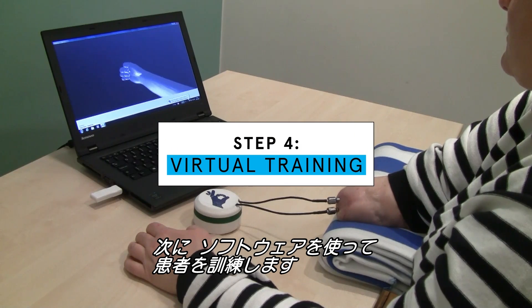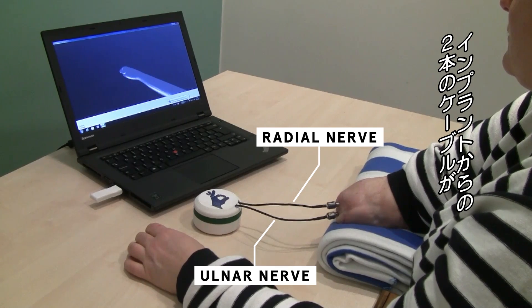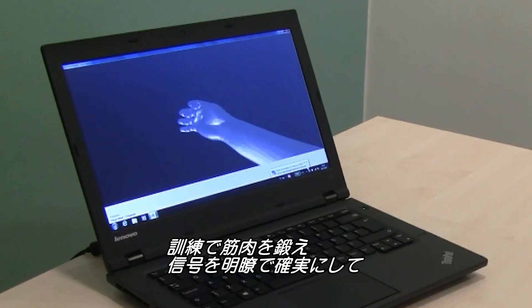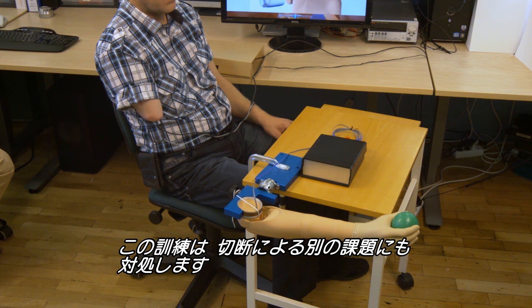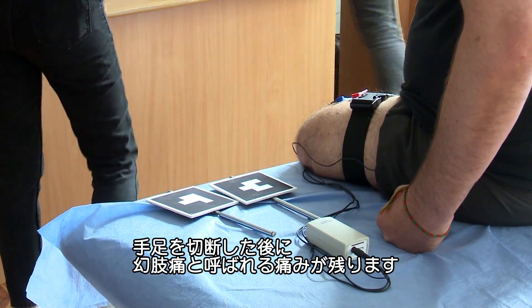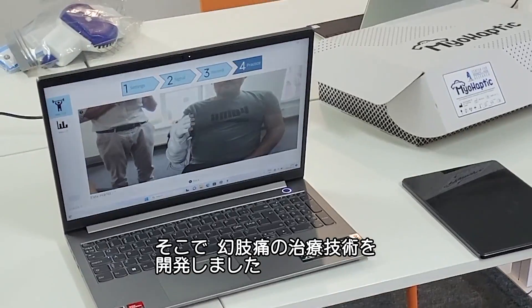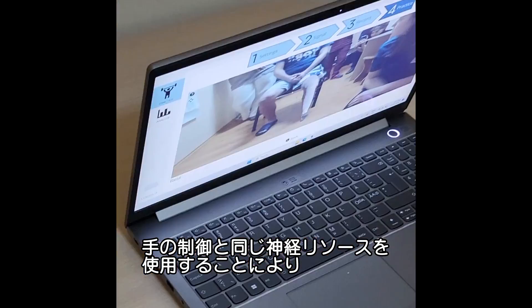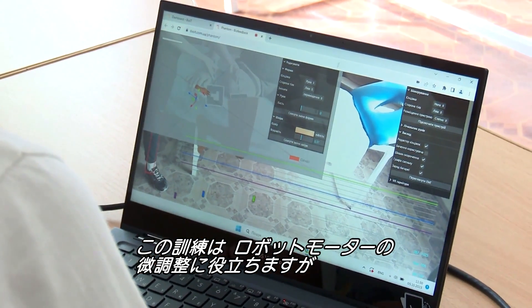The next step involves training the patient using software. The first post-surgery session connected the patient to a virtual reality system: cables from the implants send signals wirelessly to a computer, which interprets them to control a virtual limb. This trains the muscles and makes signals more distinct and reliable in preparation for the bionic limb. It also addresses phantom limb pain — caused by the brain getting confused and imagining the missing limb is frozen or twisted — by engaging the same neural resources used to control the hand, helping reduce pain and fine-tuning the motor-driving algorithms.